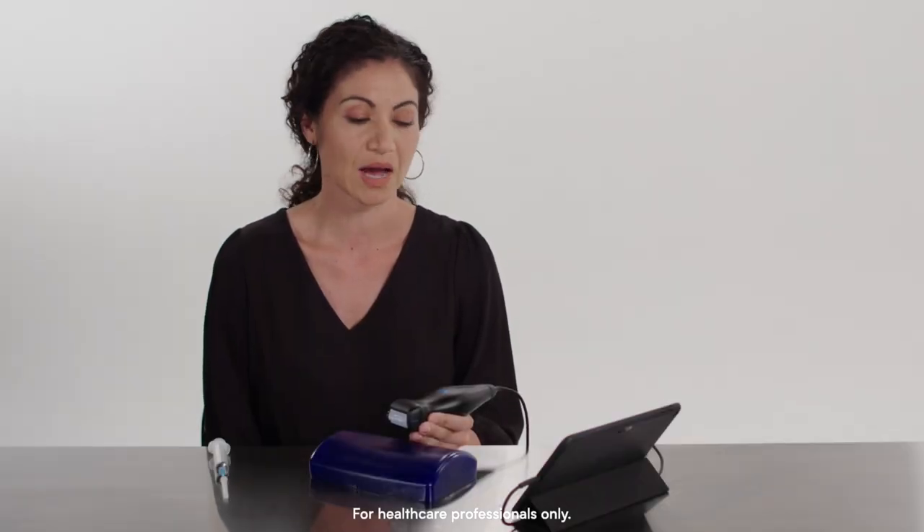I'm Teresa Lopez, Clinical Product Specialist with Butterfly. I'm going to show you the NeedleViz in-plane feature on the Butterfly IQ+. This feature is useful for in-plane guided procedures such as central line placement and peripheral IV sticks.